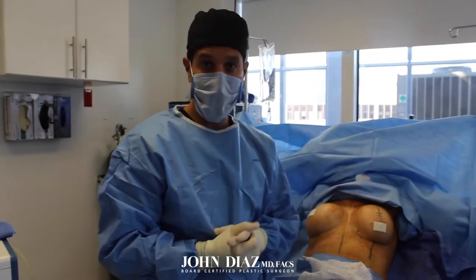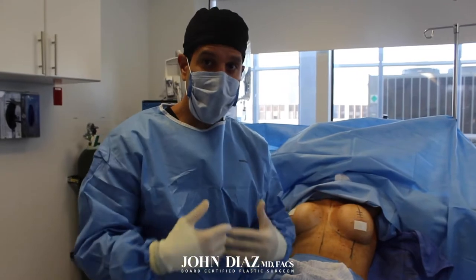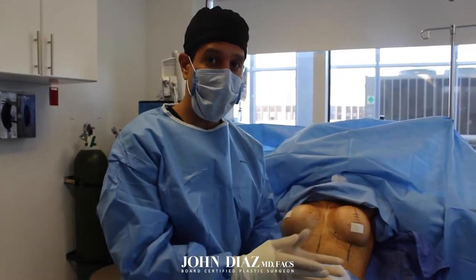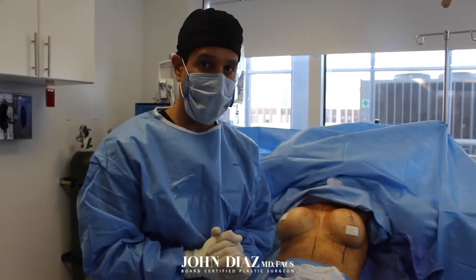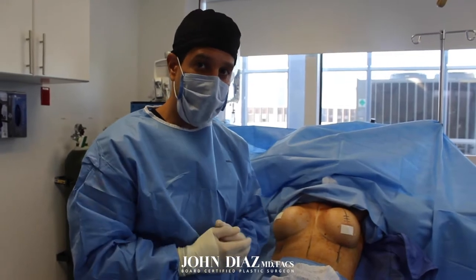Today I am doing a pretty complex breast revision. As an expert in breast surgery, I get a lot of patients who have surgery elsewhere and then come to me to fix problems that they've developed. This patient went to another surgeon and is unhappy with her result.